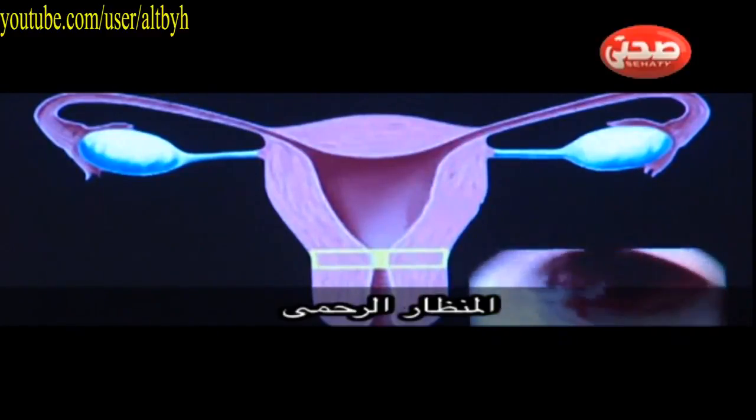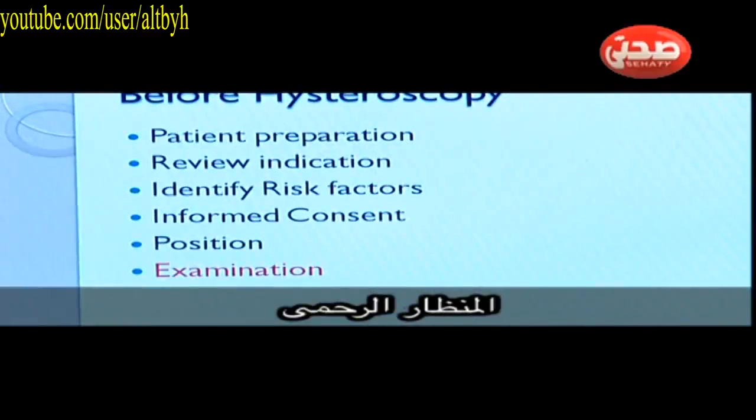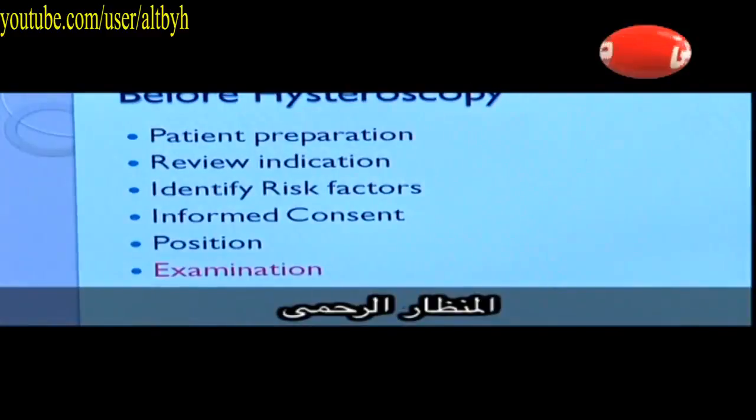It's very important before the hysteroscopy to consider the very important items. Patient preparation is very important, and being aware of the patient history is of paramount importance. We have to review the indication of the hysteroscopy and make sure it's needed, and identify the risk factors of the patient, and make sure that you are aware of the previous surgeries of the patient, or any risk factors like high BMI or previous scars in the uterus, which is very important.